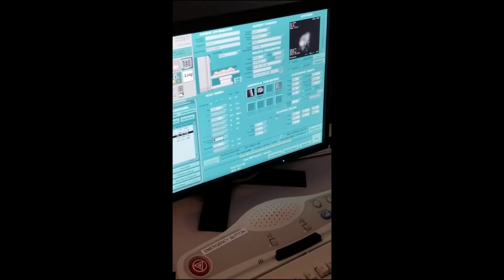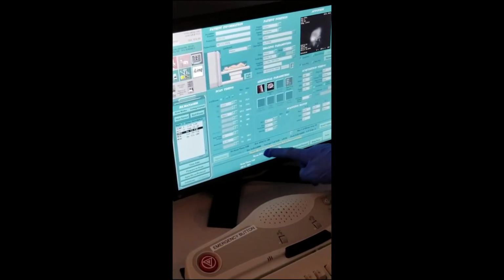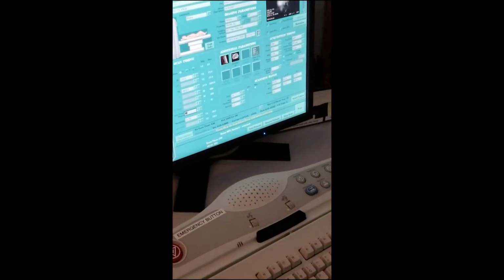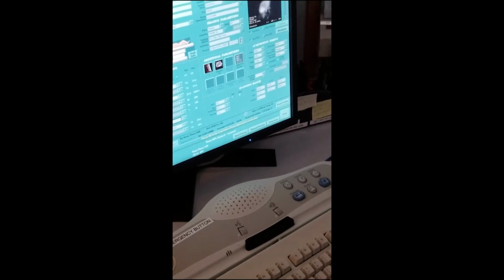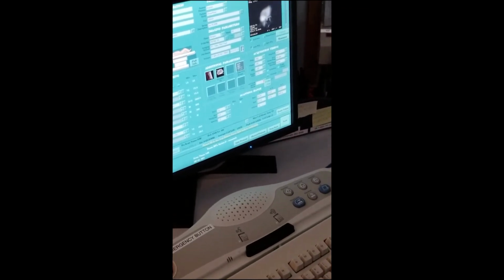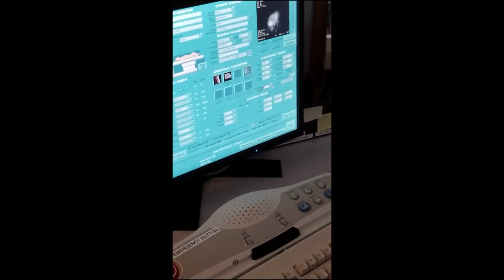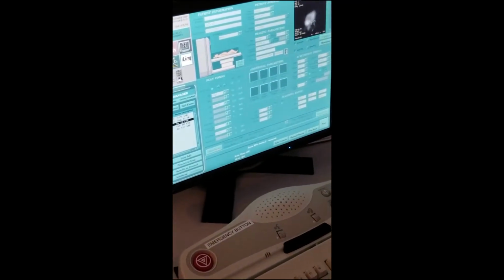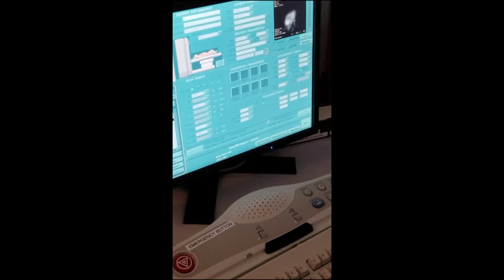It won't let me save. Why? Because you have to read. It's right here: every white box needs to be filled. If you have a box that is not filled, you put 0 for right now. Save, and then prep scan. While you're prepping, you talk.